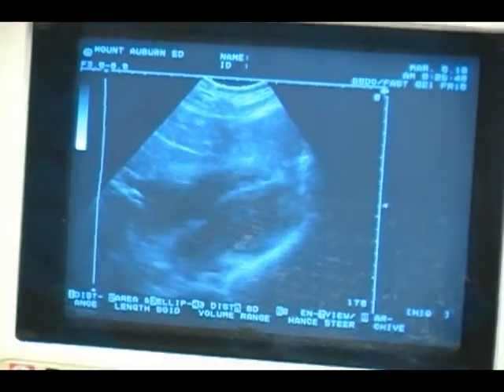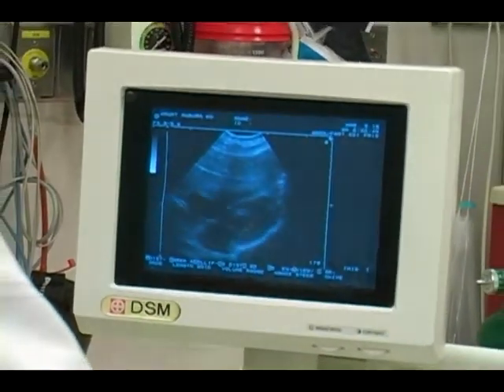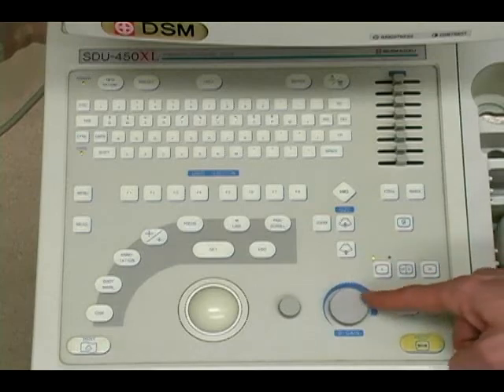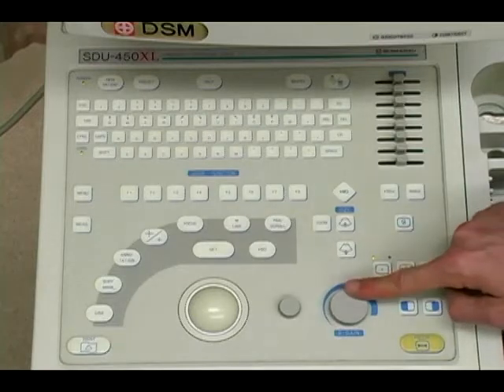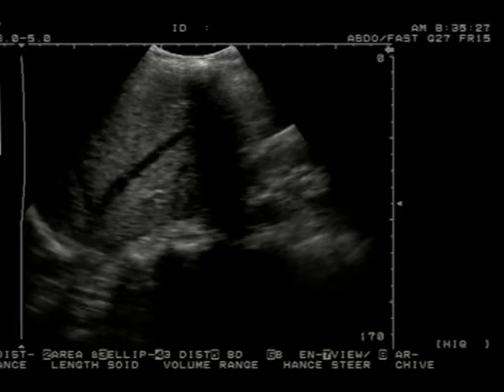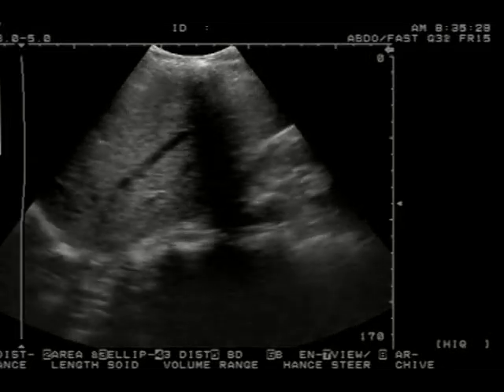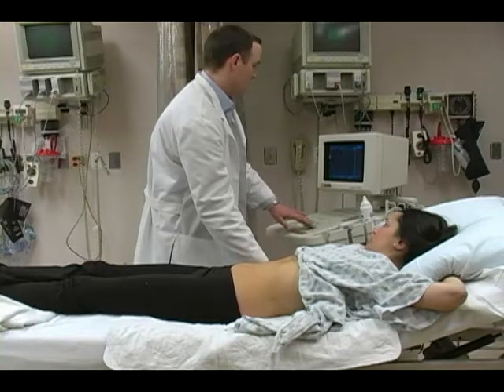During general scanning, signals return to the ultrasound probe from the interrogated tissues and an image is produced. Gain adjusts the amplification of the received signal used to produce the visual image on the monitor, similar to the volume knob in an audio system. Raising the gain will make the image brighter, whereas lowering the gain will make the image darker.